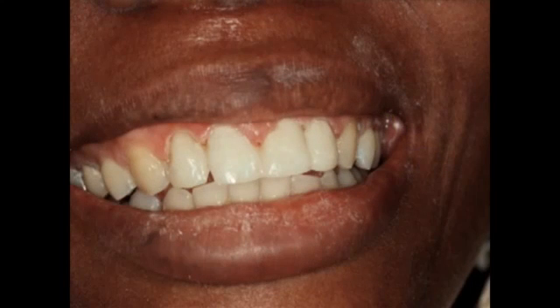This is immediately after curing. There's been no adjustment and no finishing. I want to point out the 2 enamel highlights on tooth number 10, towards the mesial of tooth number 9, more in the center of tooth number 8, and a series on tooth number 7.